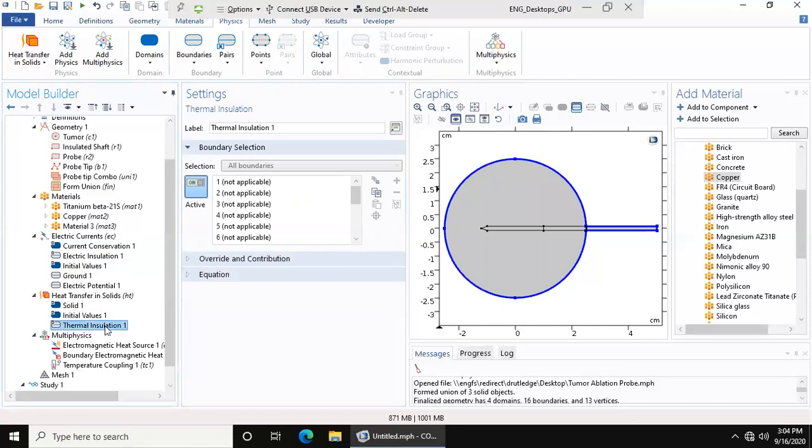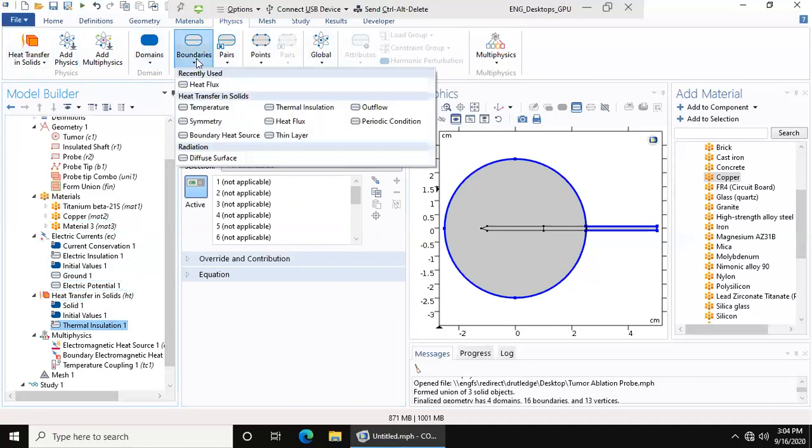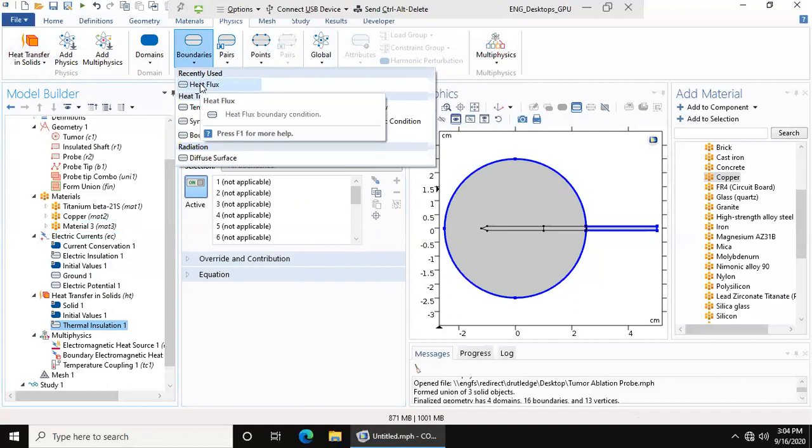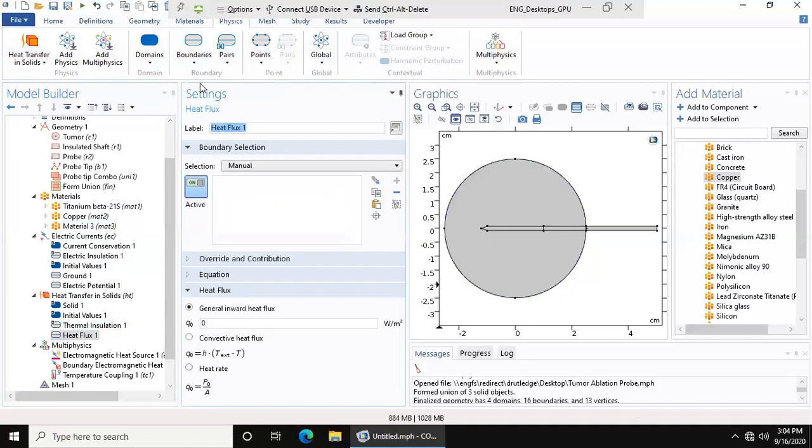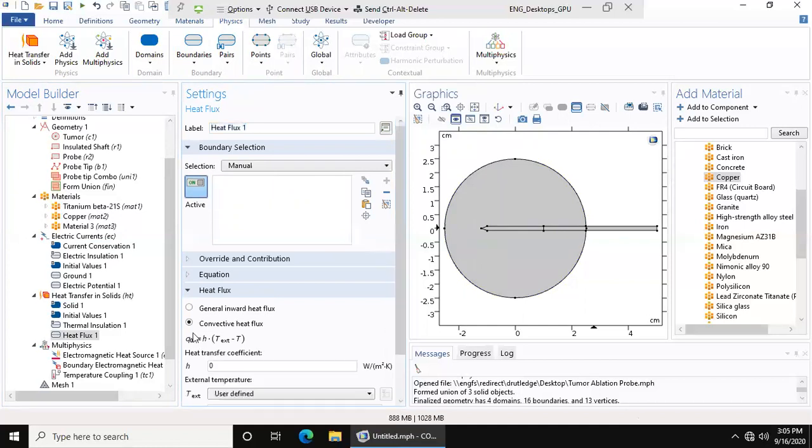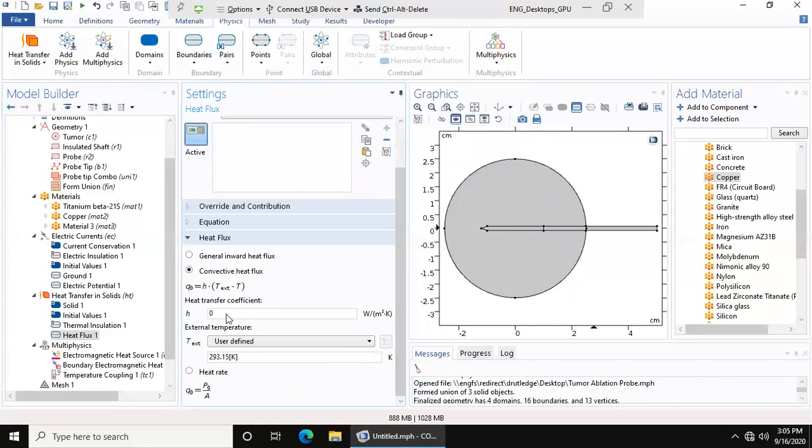Thermal insulation is the same as electrical insulation. Now that you've chosen the heat transfer in solids, it automatically comes up here on the bar. We want to add heat flux boundary, and this is going to apply to the entire model. It's not going to be a general inward heat flux, but it's going to be heat transfer coefficient, which is going to be 5 because that's a standard heat transfer coefficient, and the external temperature is going to be 310.